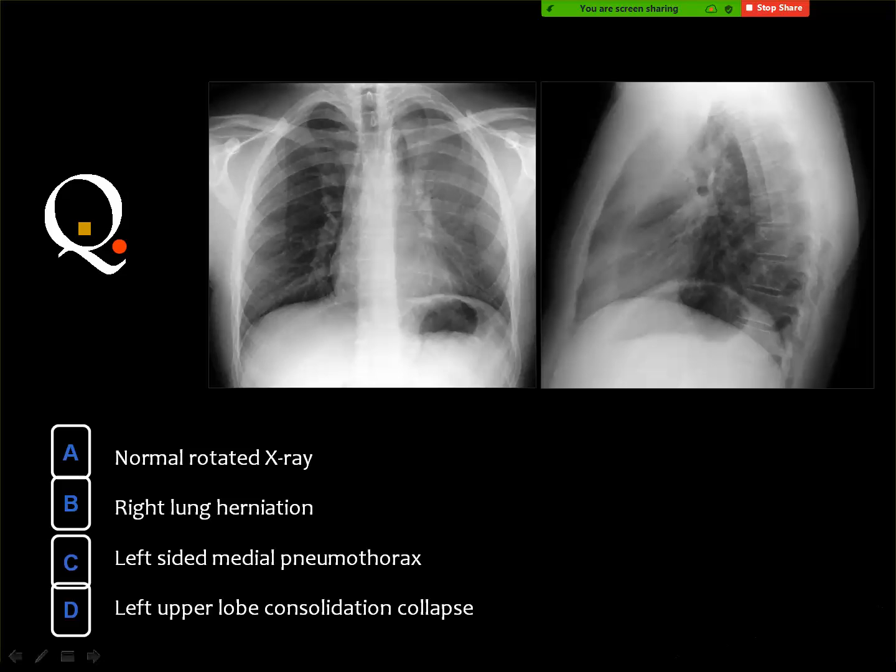Then, Dr. Mamdouh, can I ask about COVID infection superimposed in a patient with trauma? Nowadays, it's problematic, asking whether it is COVID or contusion. You mean a patient with COVID pneumonia who is subjected to trauma? Yes. You want to discriminate between COVID opacities and pulmonary contusion?